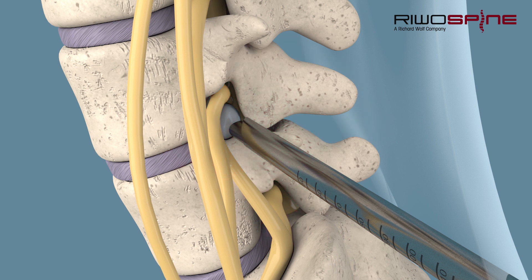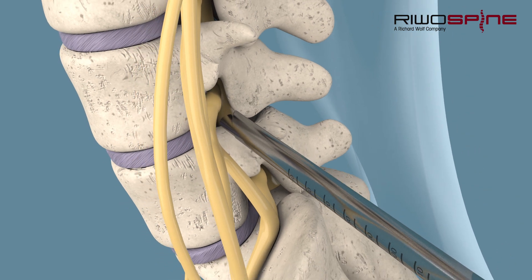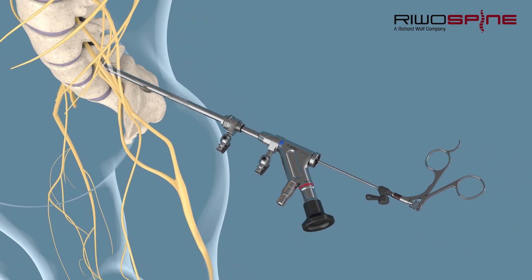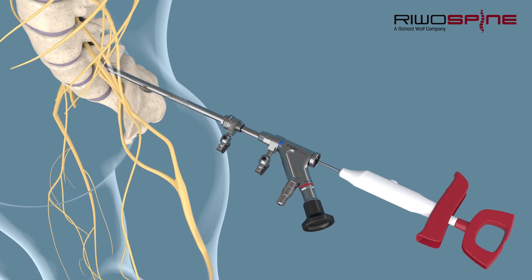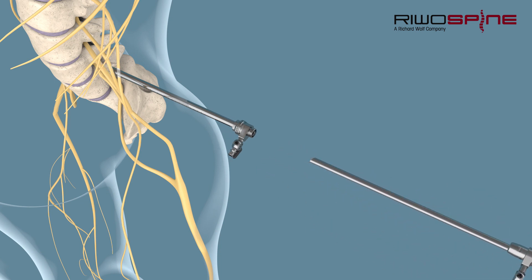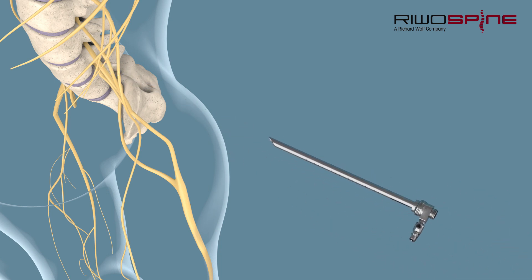The herniated intervertebral disc tissue is carefully extracted with the help of forceps to perform a decompression of the nerve structures. For coagulation of vessels and tissue, a specially designed electrode is needed. After the operation, the instruments are carefully removed.